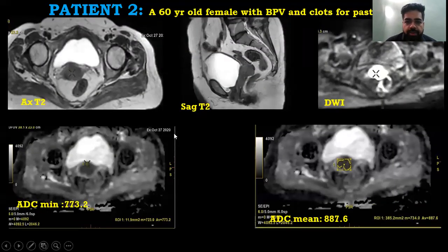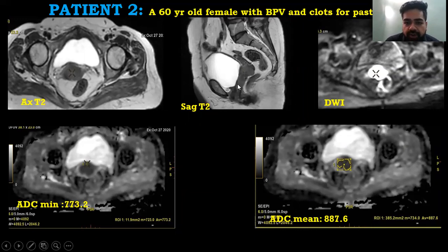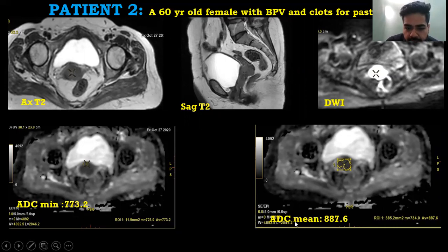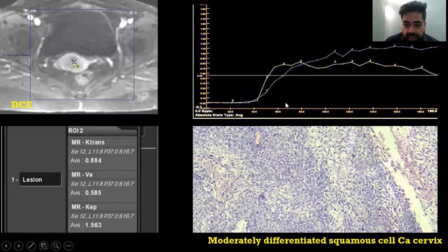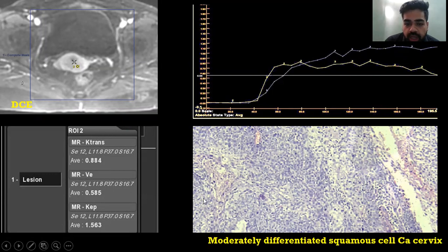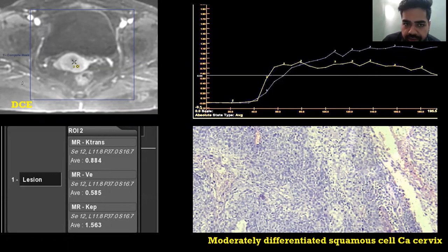Patient 2 was a 60-year-old female with history of per vaginal bleeding and passage of clots. Axial T2 showed a lesion involving the cervical area. DWI showed restriction. ADC minimum was 773.2 and ADC mean was 887.6. On DCE, the lesion again showed early enhancement compared to the myometrium. K-trans was 0.884, and histopathology showed moderately differentiated squamous cell carcinoma of the cervix.